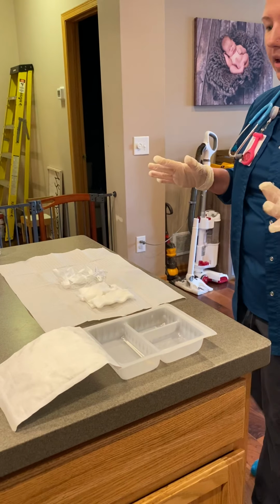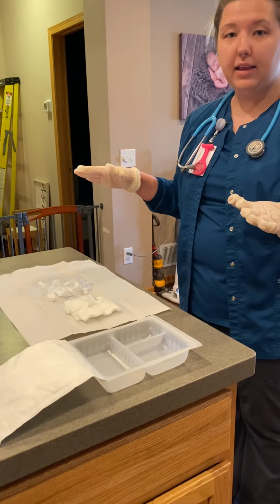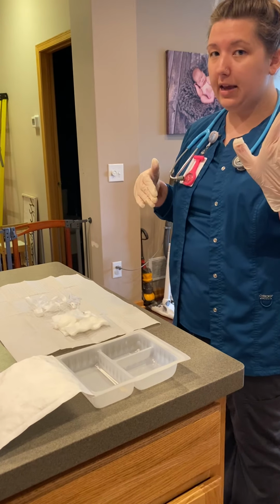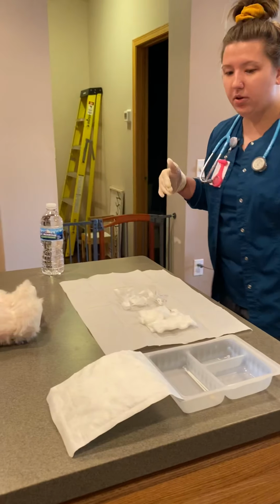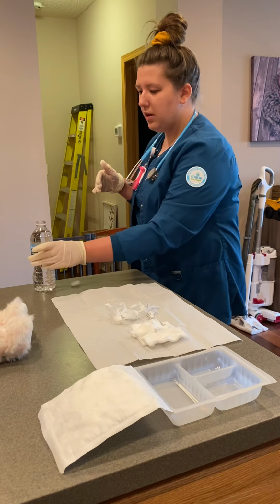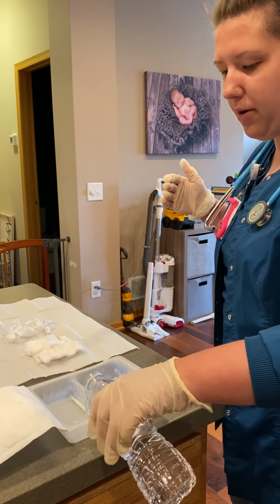Okay, so now that that is all on my field, I'm going to open my saline, and I'm going to dump it in the compartments. So I'm going to use my clean hand, and I'm going to grab it. So I'm going to go around my sterile field and open this here, and I'm going to pour my saline in the compartments.